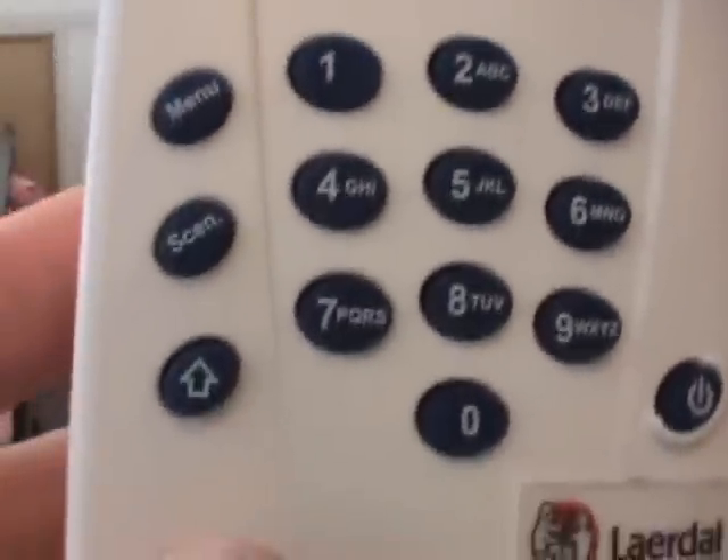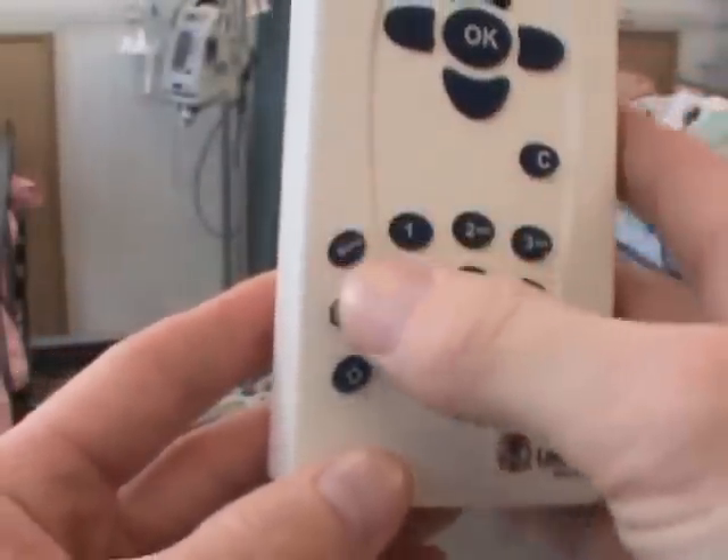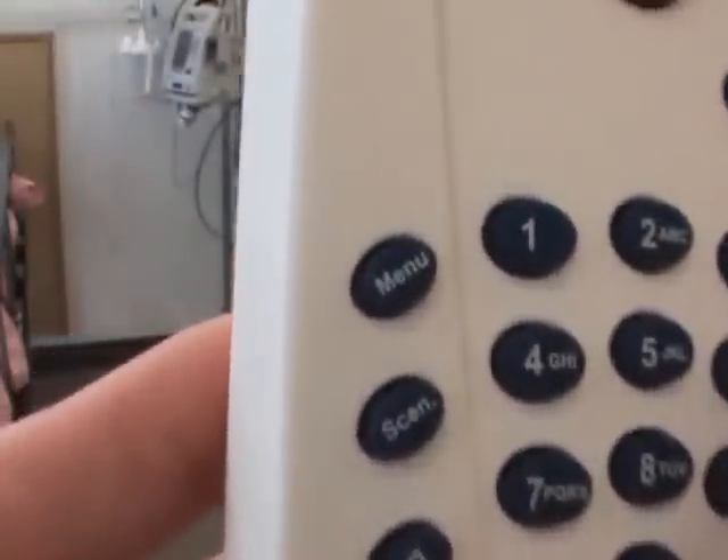Another key button you need to be familiar with is this one here — the menu button. Right here on the remote, it says menu.